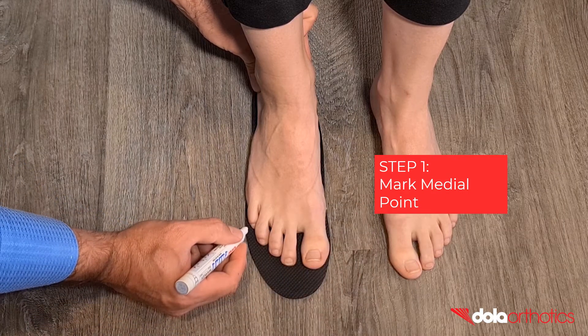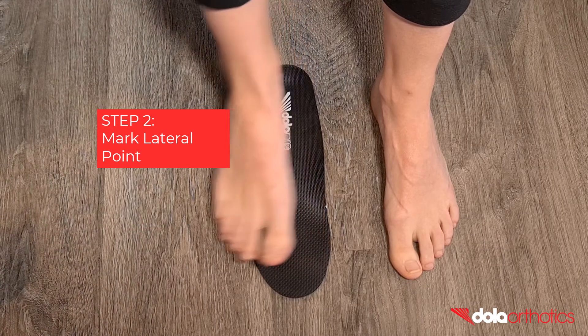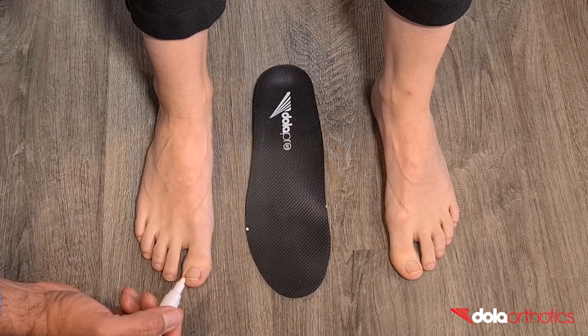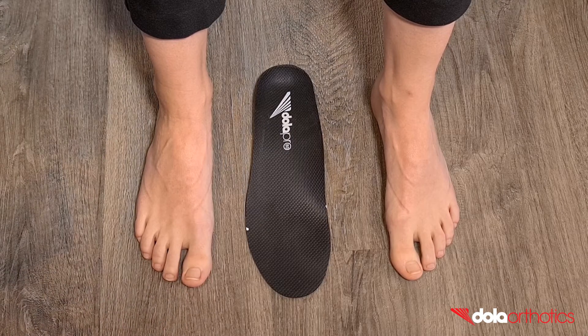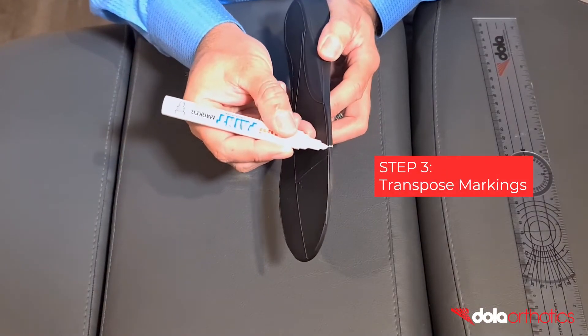Step 1: Mark the medial side of the gait plate. This will commonly be proximal to the first MPJ. Step 2: Mark the lateral side of the gait plate. For an in-toeing gait plate this is most commonly a position forward of the fifth MPJ, in this case at the apex of the fifth digit.